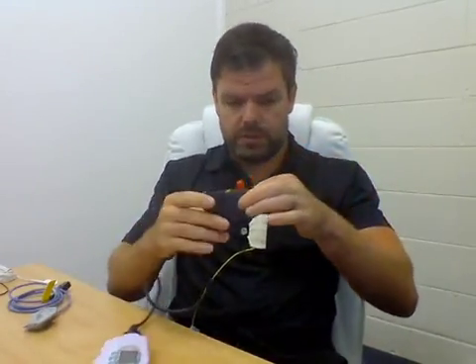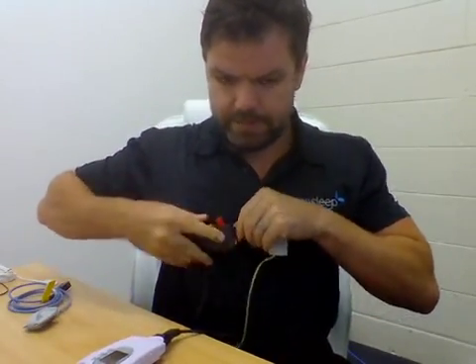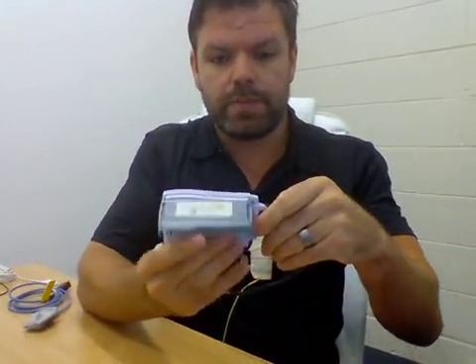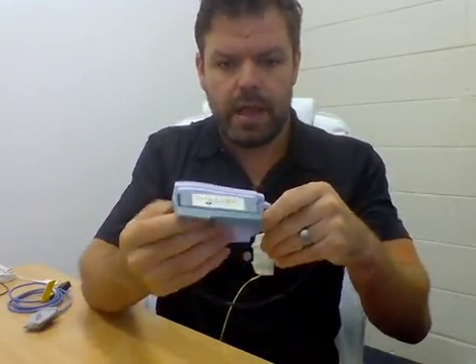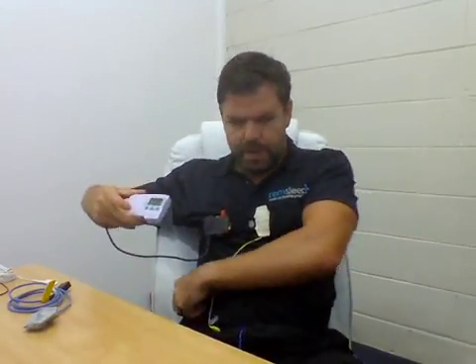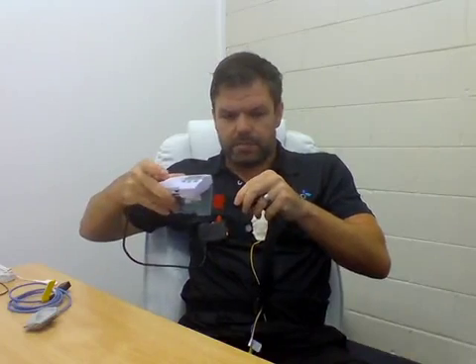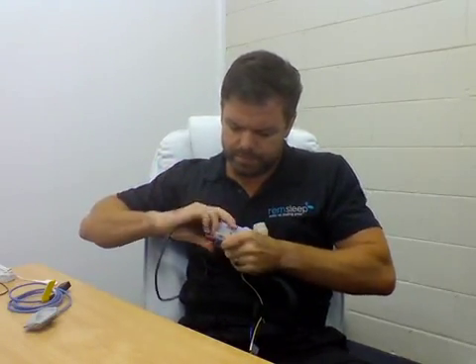So to put this recorder on, we start with the input box, and all we do is on the back there's a little clip, and we just thread it onto the thoracic band, like so. On the back of the recorder there is a little flap you see there, and what you can do is with this flap, if you hold it like this, you can actually just undo the abdomen belt and just pass it through the back of the flap like so.